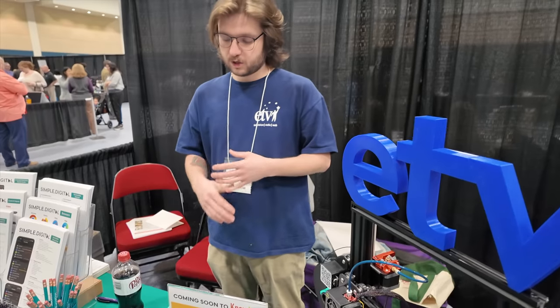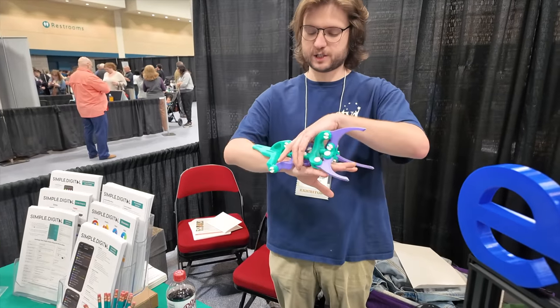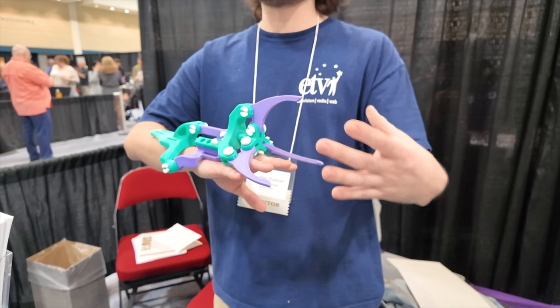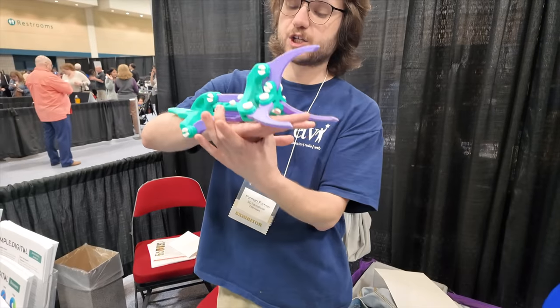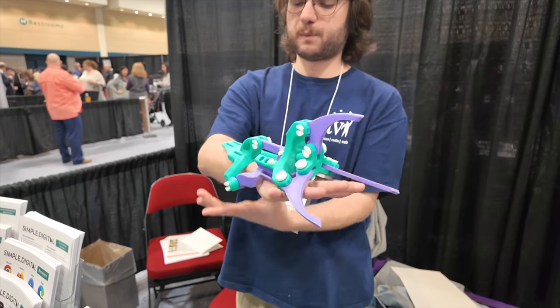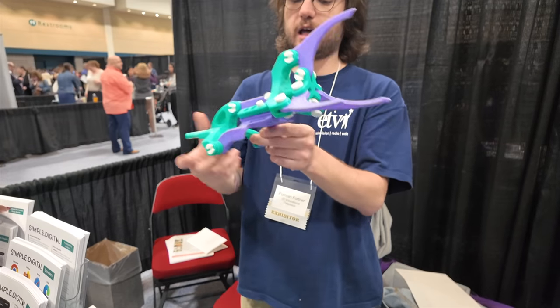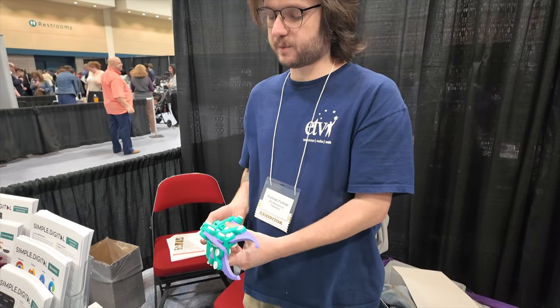Now what is this for? So this mounts to the top of your arm if you need grip assistance. This isn't to replace a prosthetic. So this is like the base model for it. There's different ones that do more things, like there's one that grips coffee mugs and stuff like that. But a strap would go around here, and a strap would go around here, so that when I flex my wrist like this, it would engage the claw. So it would help me grip stuff and grab stuff.